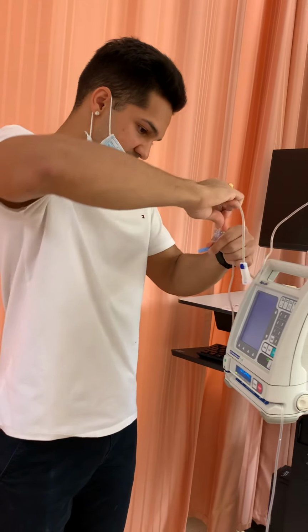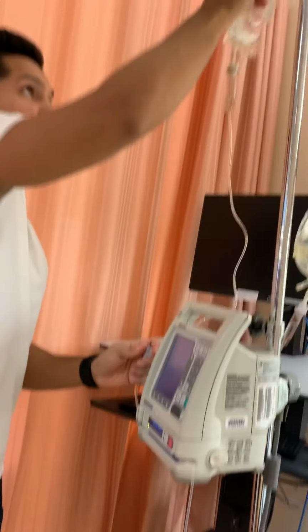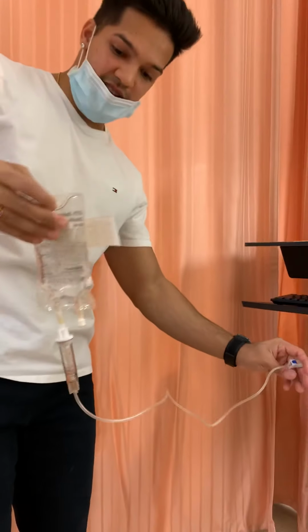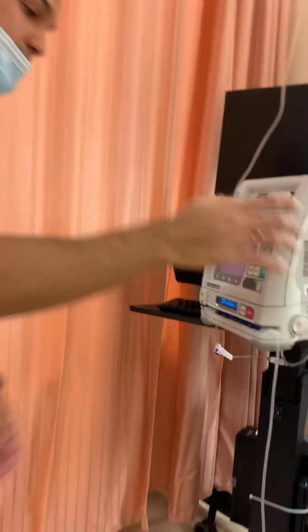and aseptically attaching it. And once I've attached it, I'm just going to be opening my port up, and then I can lower it below my primary, to back prime it, and then just to get rid of all the bubbles in my secondary line, and it's half full. This is half full, so that's good. And now I can hang this back up. Now I can go to my secondary.